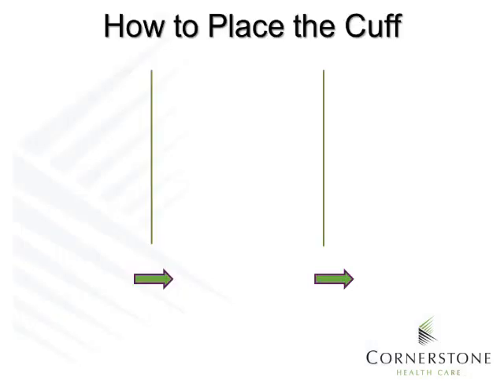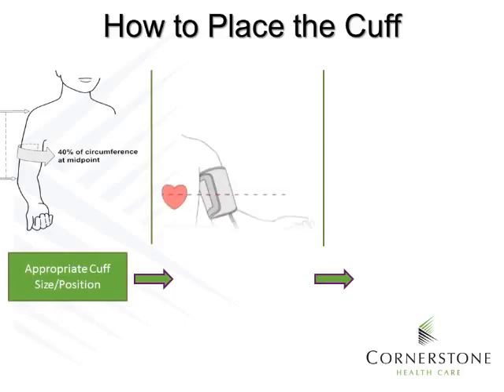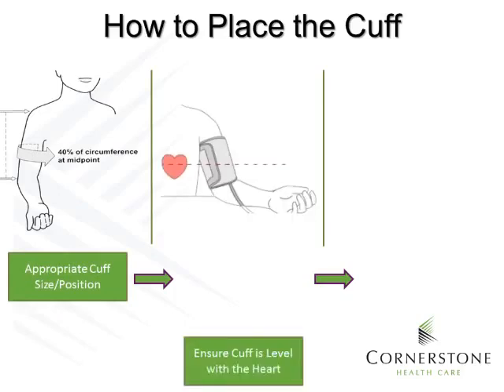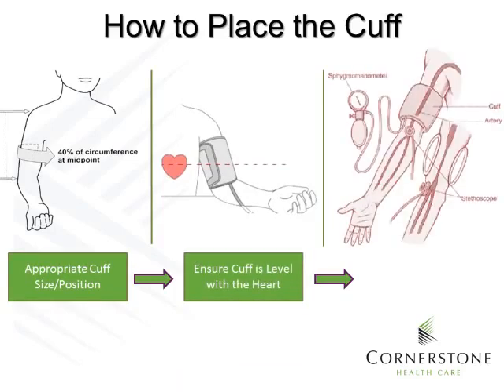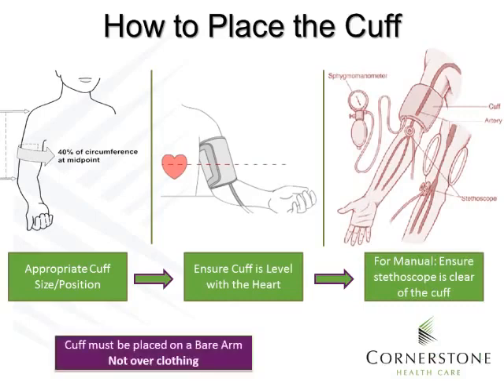An important factor for accurate blood pressure measurement is the placement of the cuff. First, select the appropriate cuff size and position it correctly on the patient's arm. Ensure that the cuff is level with the heart. For manual blood pressures, ensure that the stethoscope is clear of the cuff. Finally, the cuff must be placed on a bare arm, not over clothing.